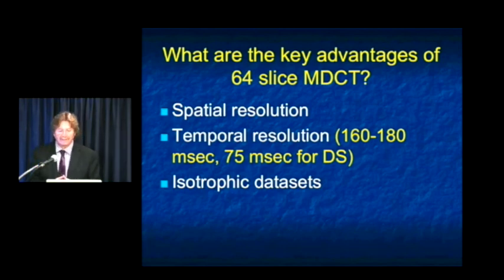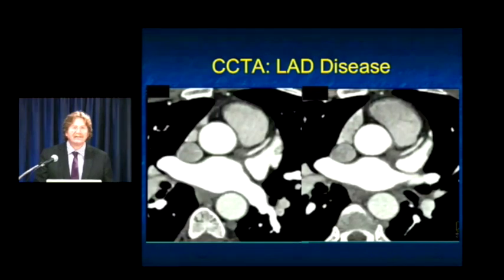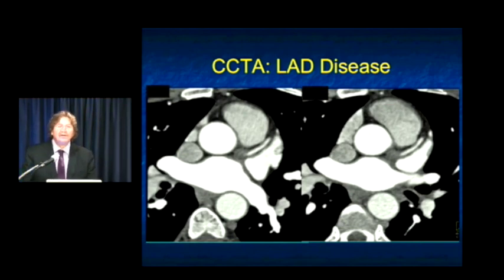Now, when you think about CT and its developments, there was one application that is a small part of CT but has driven it, and that's been cardiac CT. And the reason is everyone's competing who can do the best cardiac CT at the lowest dose with the best resolution. Well, the good news is everything that was developed for cardiac CT works for everything else we do. Cardiac CT is the biggest challenge. You have a moving structure and you're trying to look at a vessel that's a few millimeters in size and detect the presence of a stenosis of 50% or greater.